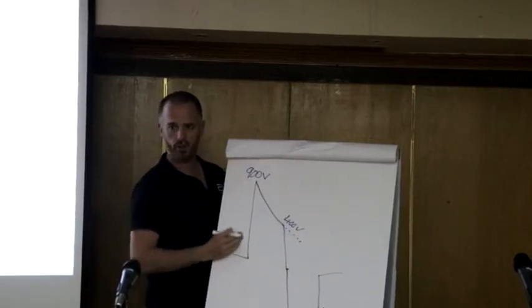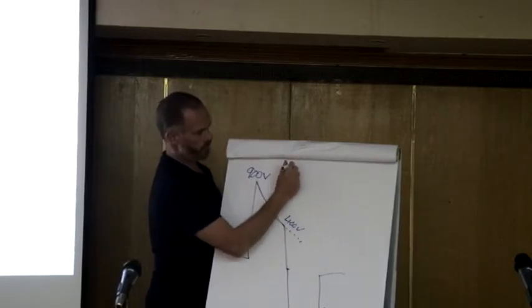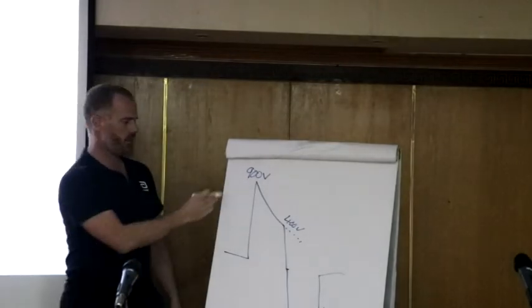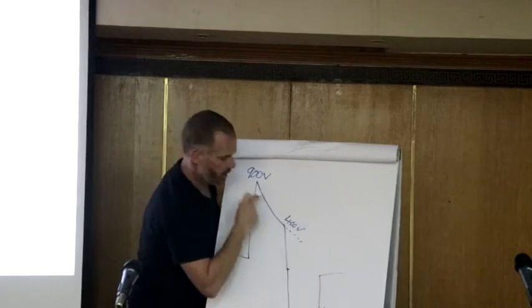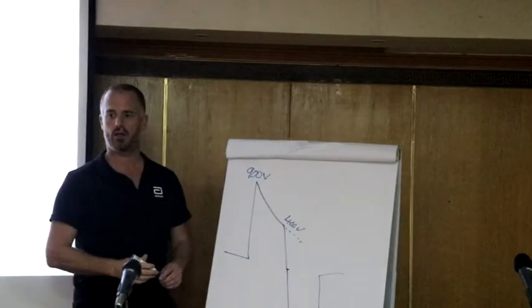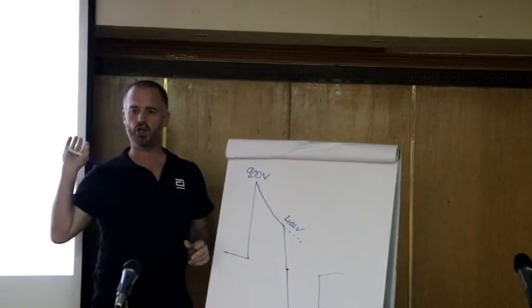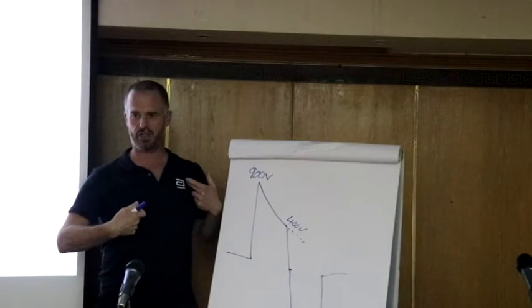So it's a longer waveform. The higher the tilt, the longer the waveform. Just imagine I go to 100% tilt. Well, that's to zero, right? If the impedance is low, you can get there faster. But that's the passive characteristic of the tilt. It's current running across a resistor. The resistor is the patient.